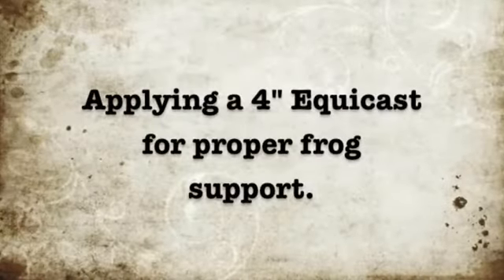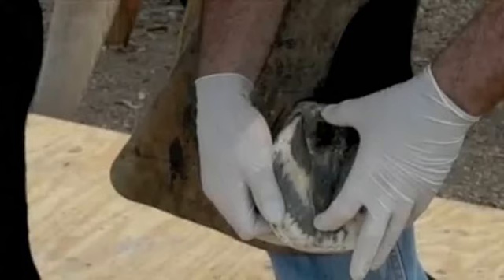Applying a 4-inch equicast for proper frog support. Sometimes using a larger cast, like a 4-inch cast on a smaller foot, is necessary to add proper frog support.